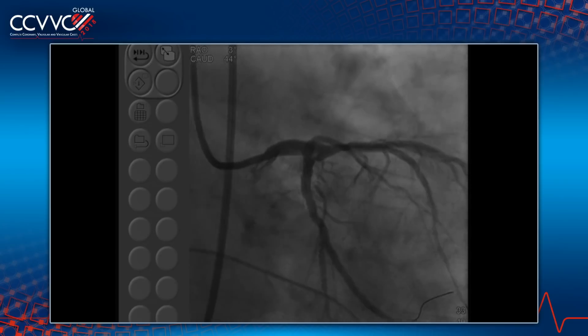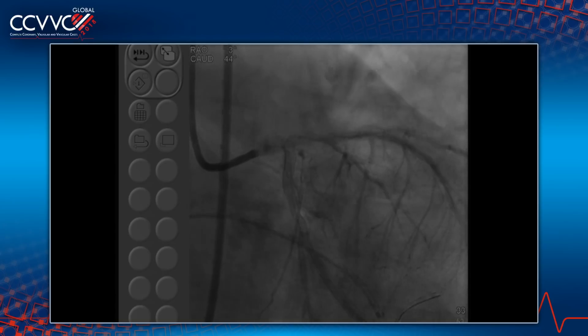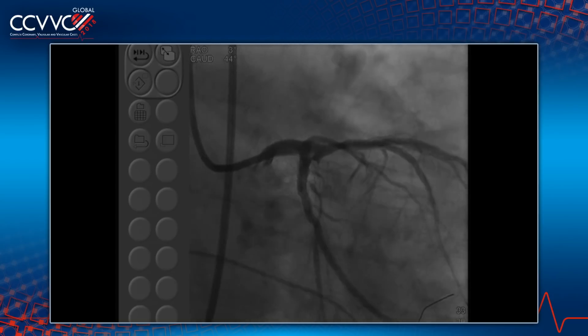Are we done with the IVUS of the LAD, or do we go to another room? We are going to IVUS the LAD bifurcation. Are you done with that step? Done?